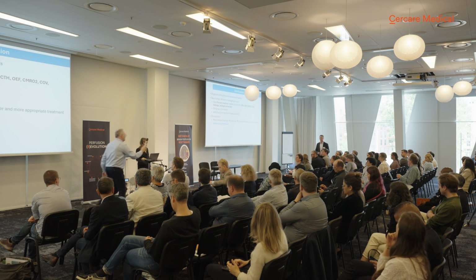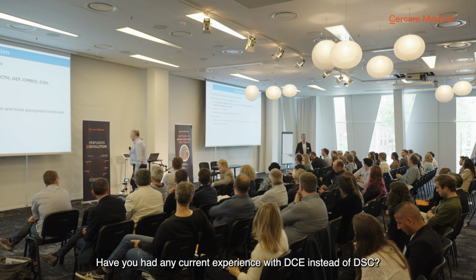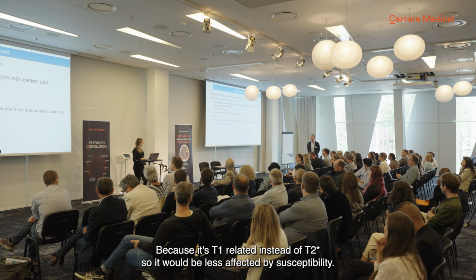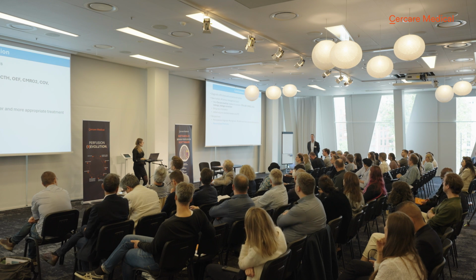There's a question here. Have you had any current experience with DCE instead of DSC? Because it's T1 related instead of T2 star, so it would be less affected by susceptibility artifacts.